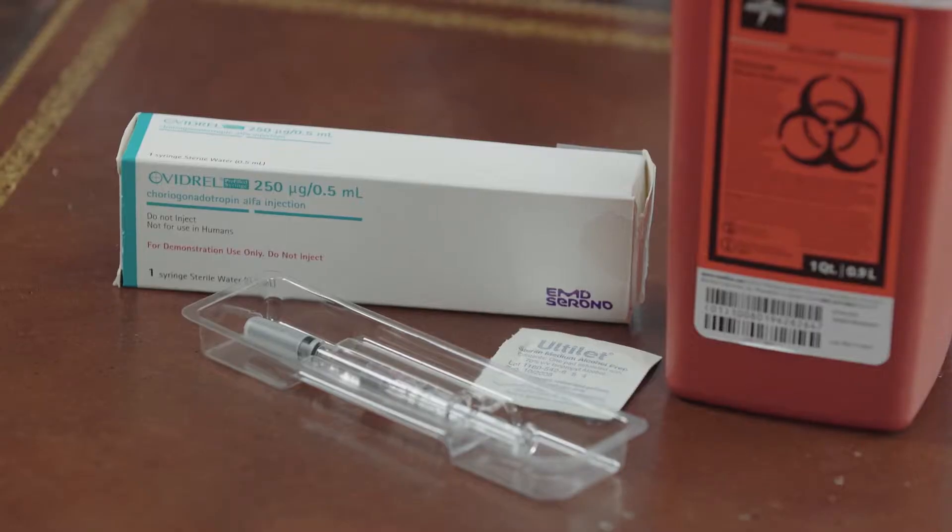I'm going to demonstrate Ovidril. Ovidril we refer to as the trigger shot. The doctor will have you inject the Ovidril when the follicles are ready to release the eggs.